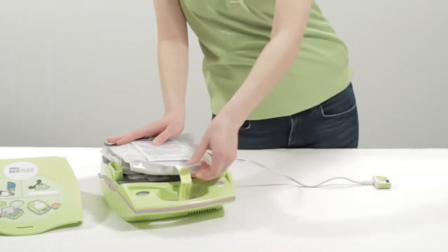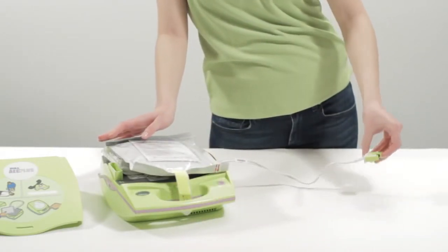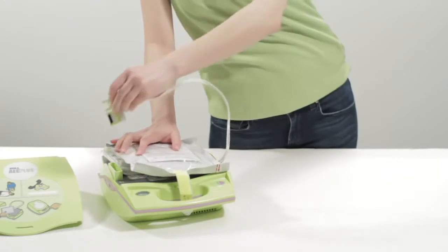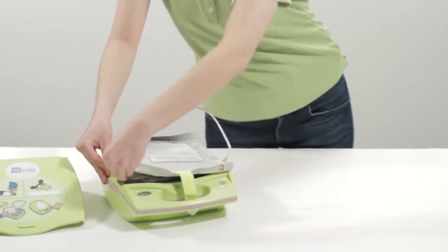The white electrode plug will now be sticking out slightly from the package. Hold the package down and plug the cable into its socket. Press down with your thumb to make certain the plug is seated firmly.